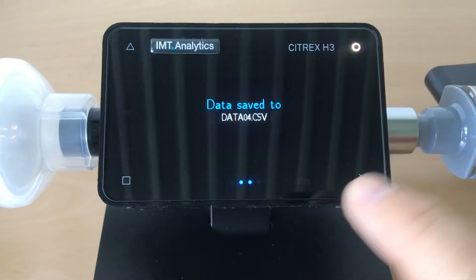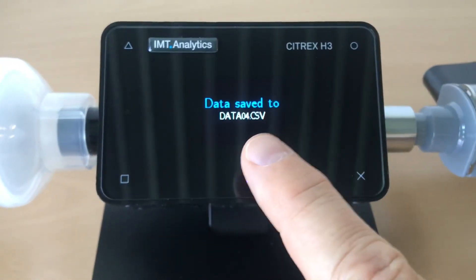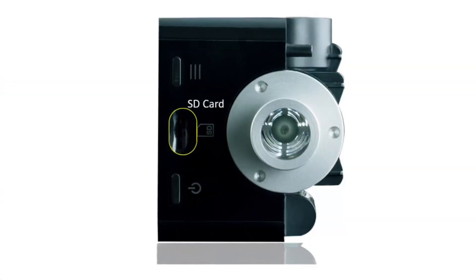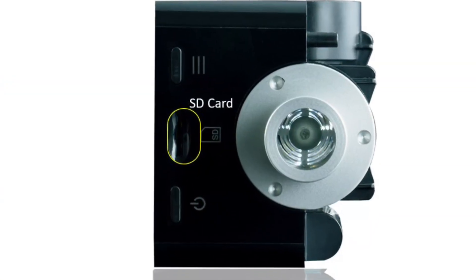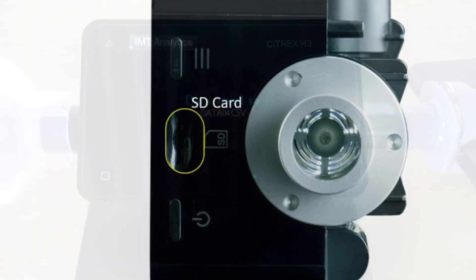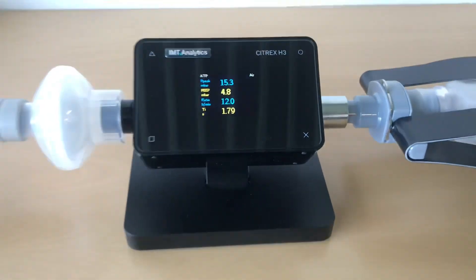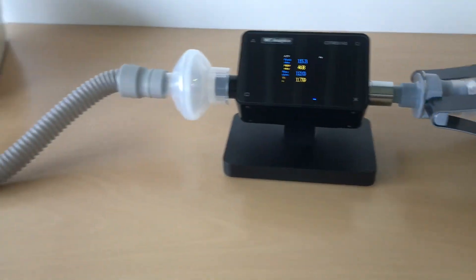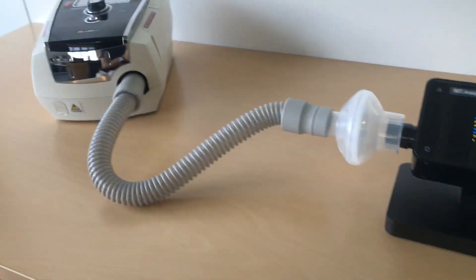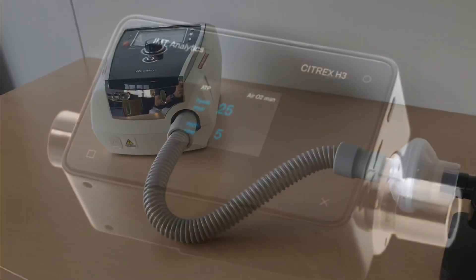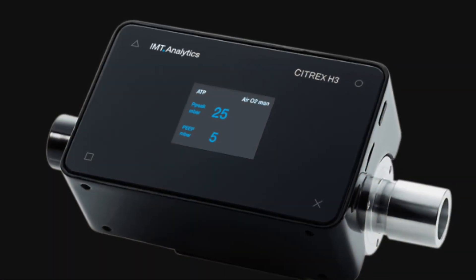At the end, you save the data — you can export it to the PC via SD card and make an audit report. That's it. It's very simple to test the ventilator in this way.